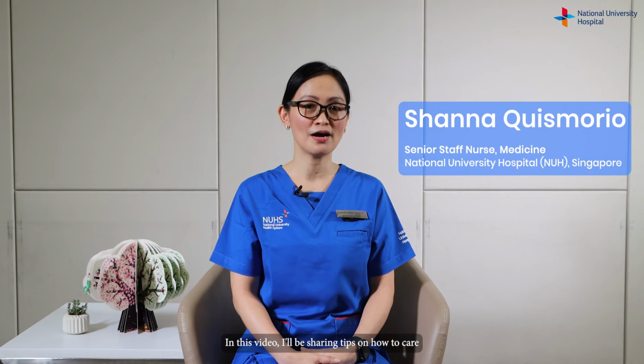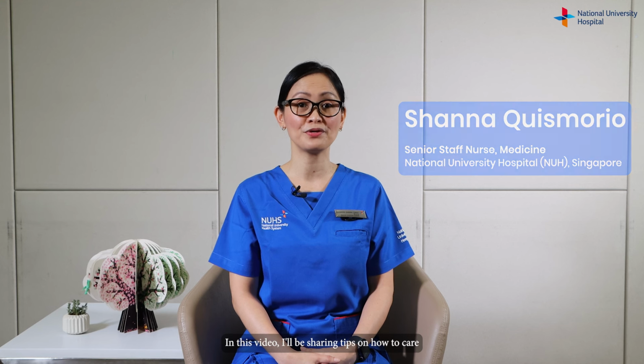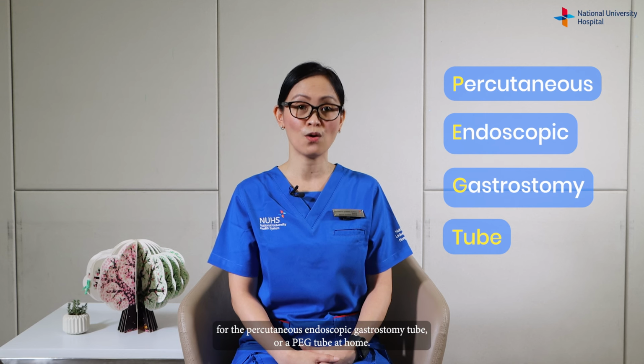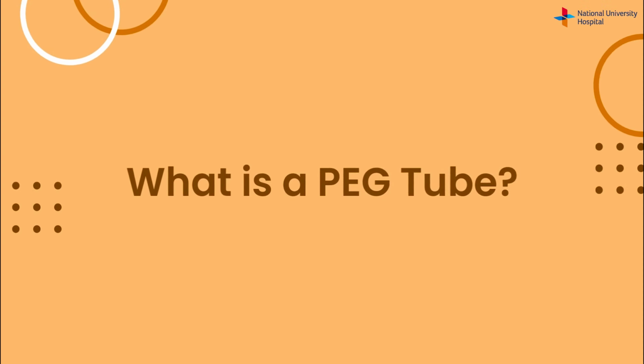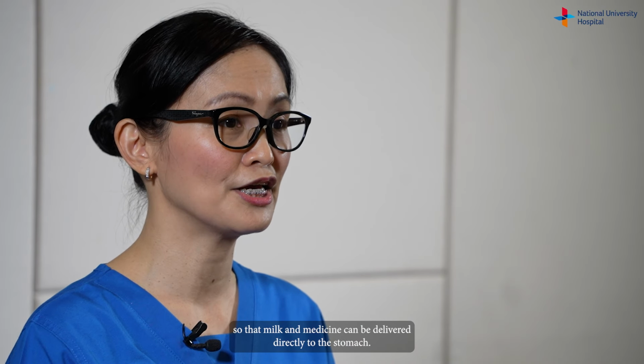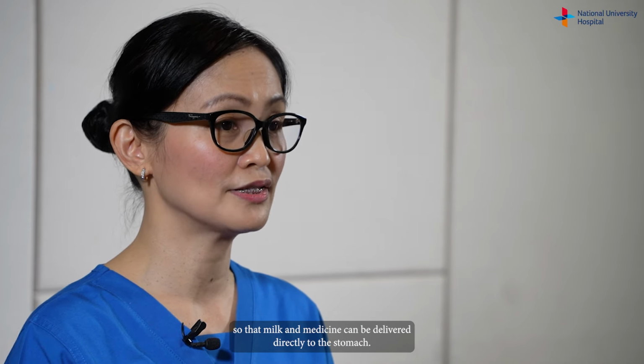In this video, I'll be sharing tips on how to care for a percutaneous endoscopic gastrostomy tube, or a PEG tube, at home. A PEG tube is a feeding tube that is inserted into the stomach so that milk and medicine can be delivered directly to the stomach.